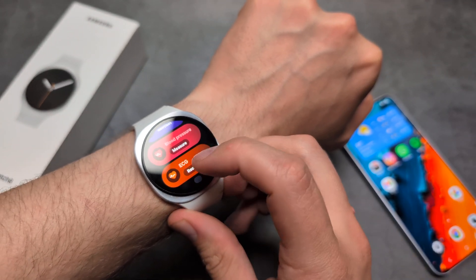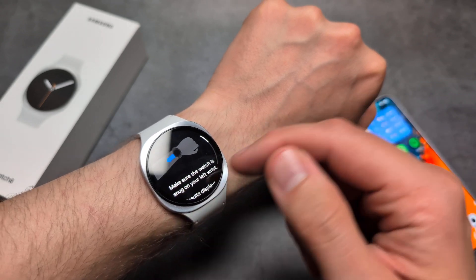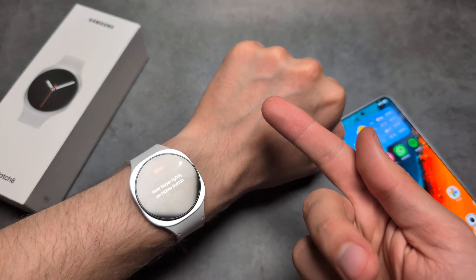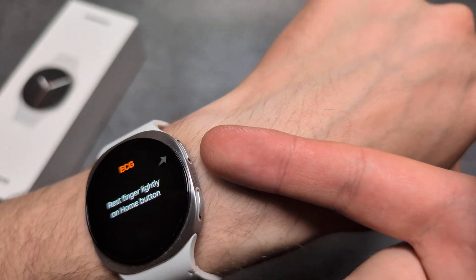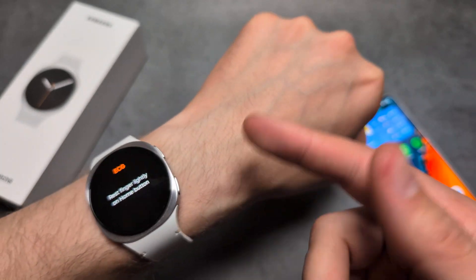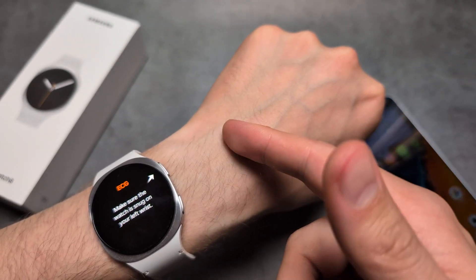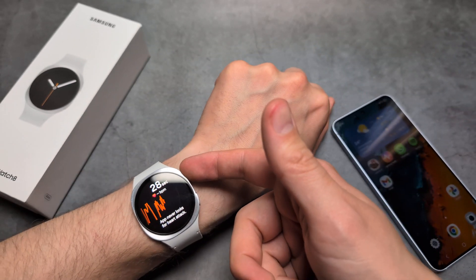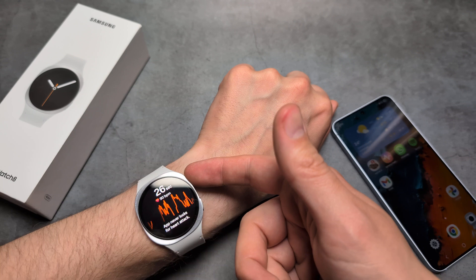The first time you click it will ask you for a bunch of things. Then we simply need to take a finger and rest it on this upper button over here. While you do this, make sure not to touch yourself — only the button. Let me hold it like this and also stay very still.